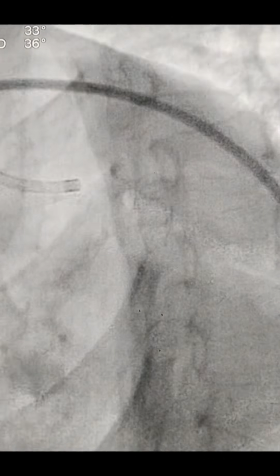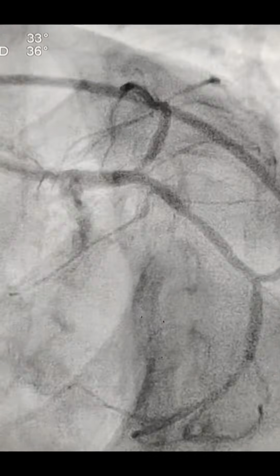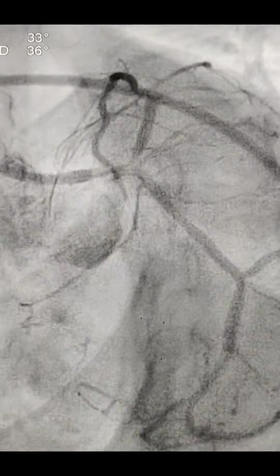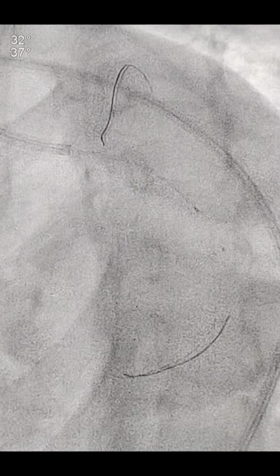So we decided to do the LM to LAD angioplasty, and there was a lesion in the mid LAD, so we decided to do the angioplasty in the mid LAD also. So we ordered IVUS. This was through the right femoral route. This is the JL catheter, 6 French. We crossed the BMW PTCA wire in the LAD, and then a second wire in the LCX. And this was the IVUS catheter in the LCX.